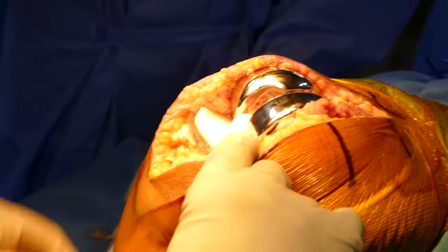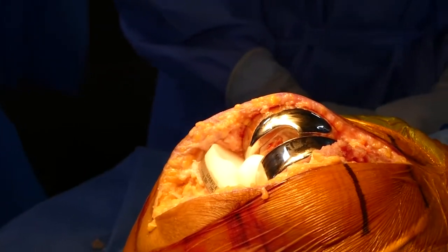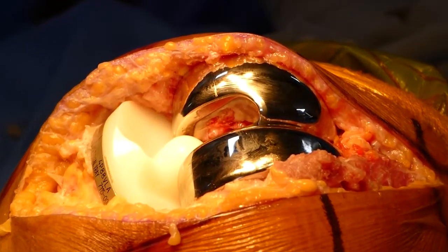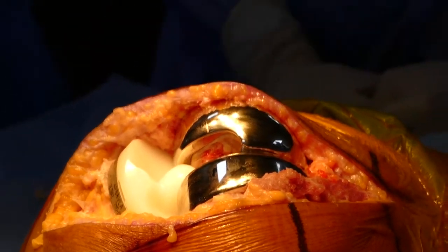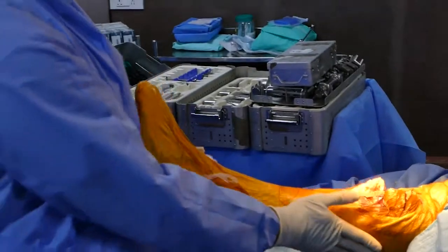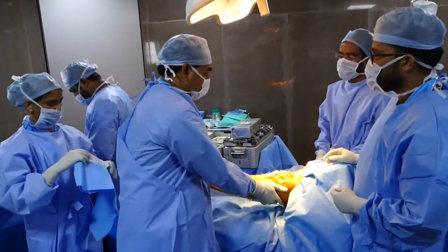That is the final stage of the surgery, which takes around 10 minutes of final preparation. Once everything is ready, we go ahead with the final procedure. We open the sterile implants, wash the joint again, and go in with the cementation procedure. Once the joint is fully implanted, we wait for 10 to 15 minutes for the cement to set, so that the whole joint is totally cemented into the bone. Then the joint is washed again, closed in layers, and the patient is brought out of the theatre. So that's how the surgery goes.